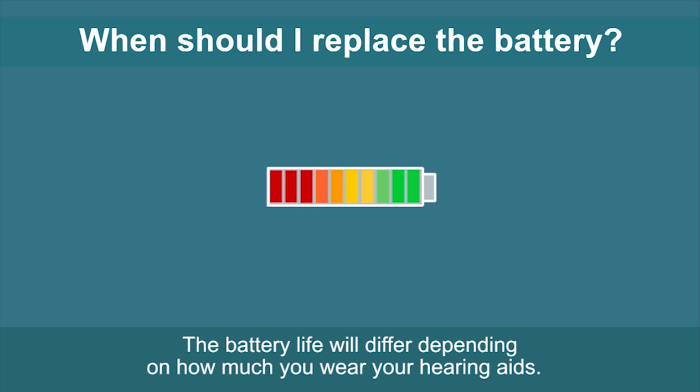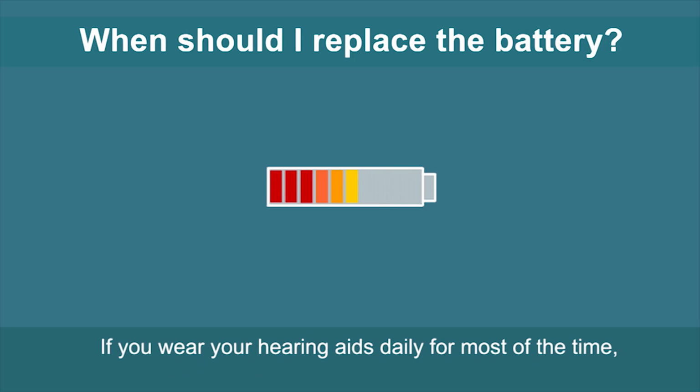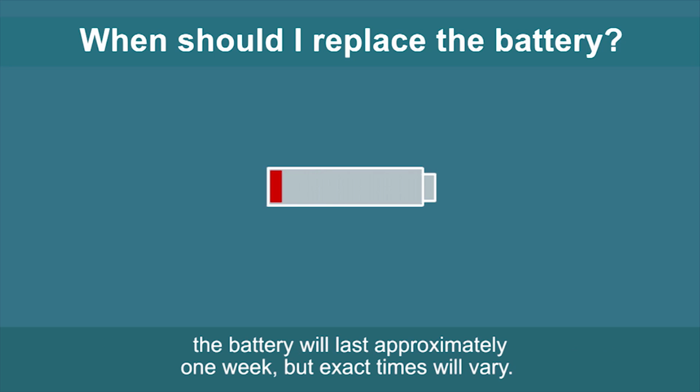When should I replace the battery? The battery life will differ depending on how much you wear your hearing aids. If you wear your hearing aids daily for most of the time, the battery will last approximately 1 week, but exact times will vary.